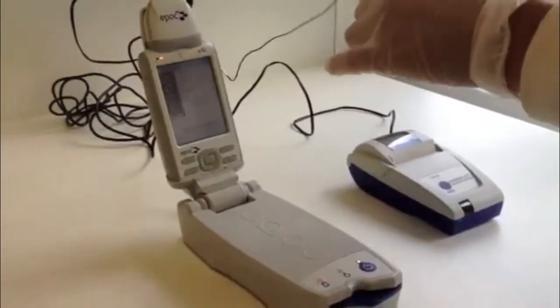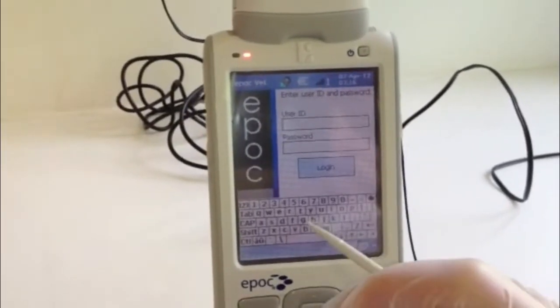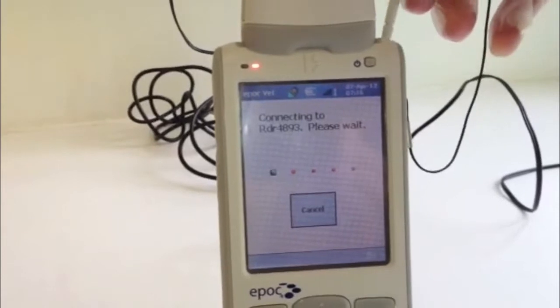From the login screen, enter your initials using the stylus pen provided by selecting the keyboard icon at the bottom right of the screen. A password is not required. Click login and the host will automatically connect to the reader by Bluetooth.